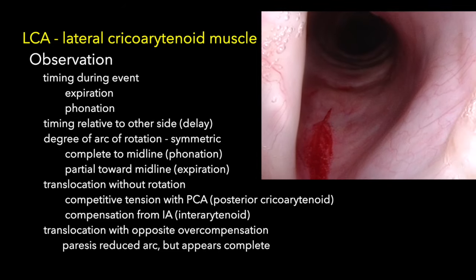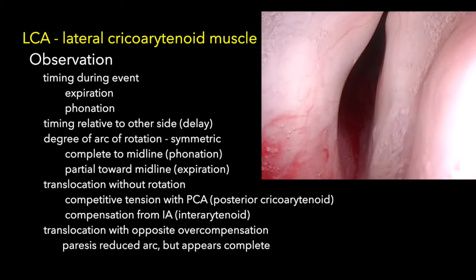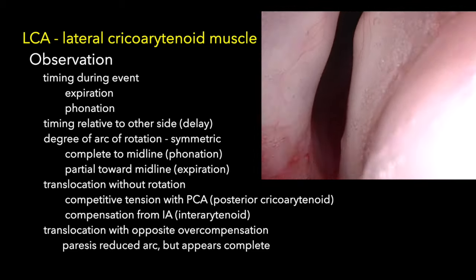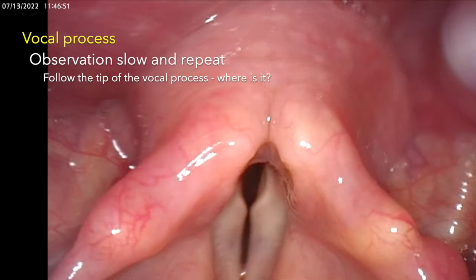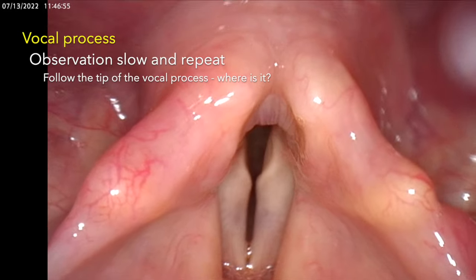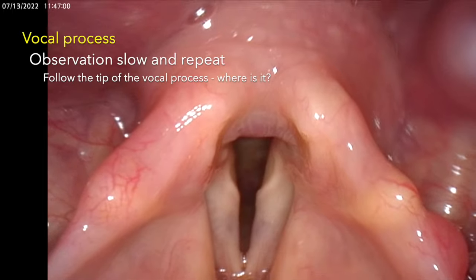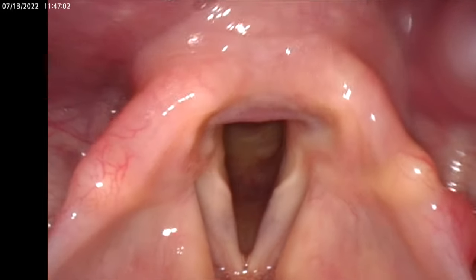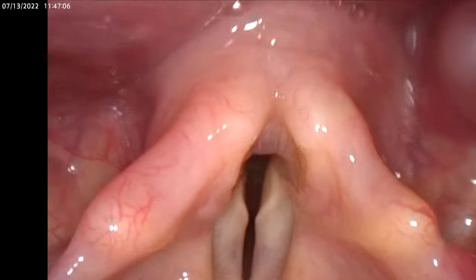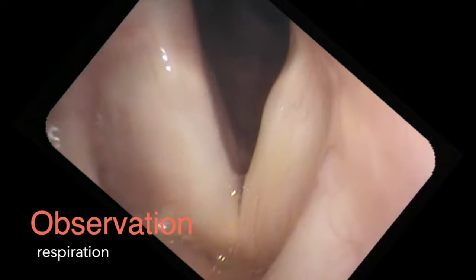And finally, there's translocation with opposite overcompensation - the vocal cords look like they've completely closed and lined up, but one side is paretic, has a reduced arc, but it appears complete because the opposite side goes past the midline. So these are some of the observations we can look for. We're training ourselves to look at each vocal process, and it can be hard to look at them both at the same time. Sometimes you want to slow it down, look at the left, look at the right, and repeat.